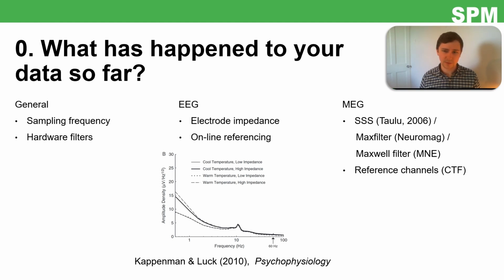And you can see that for the low frequencies, that effect on resistance that varies across frequency that impedance has, it's added noise essentially to the high impedance electrodes for those sub 10 Hertz frequencies, and you can imagine how that might be a problem if that varied across your conditions, or even across units of observation. It would be quite problematic. So make sure your impedance is low, and certainly make sure you record it.